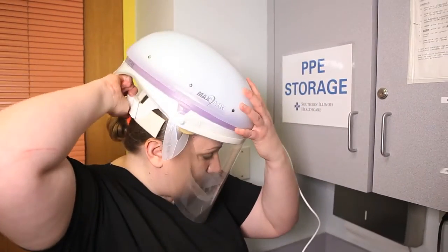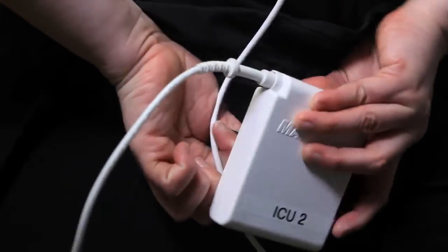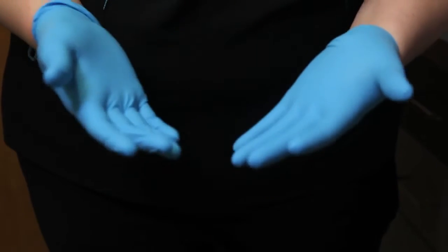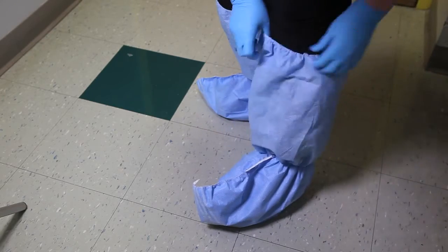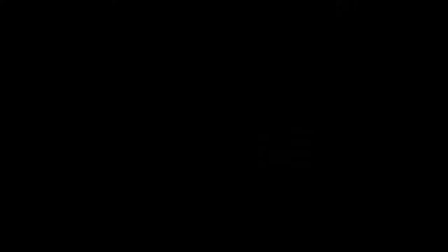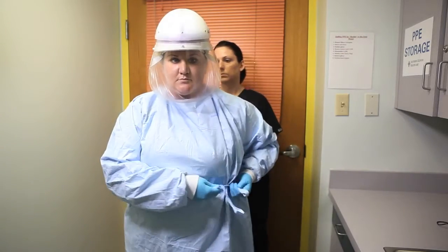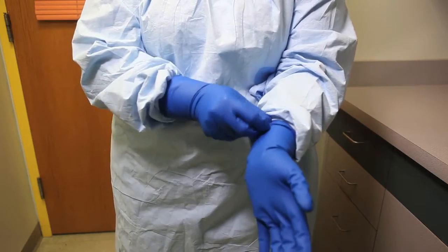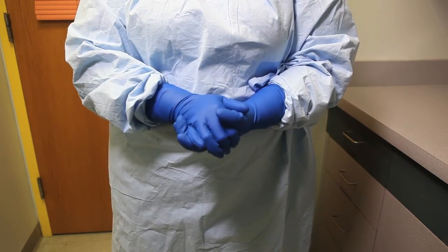Don capper. Attach battery pack to back of scrubs. Don regular gloves. Don boot covers. Don micro cool gown. Don extended cuff gloves. Be sure to tuck the cuff of the gown into the gloves.